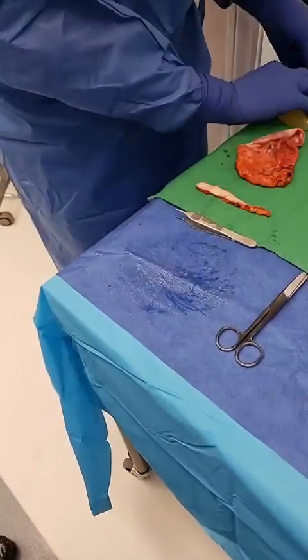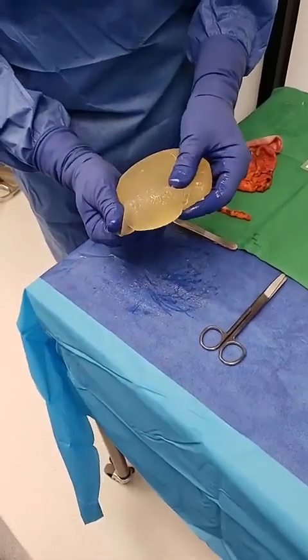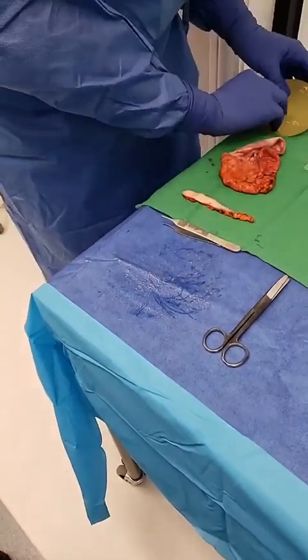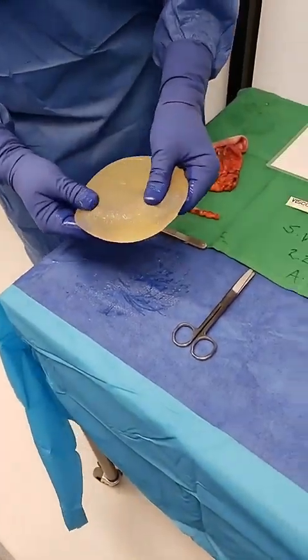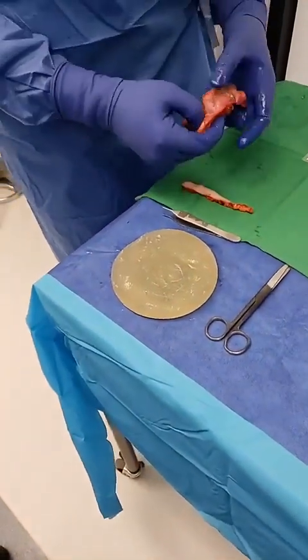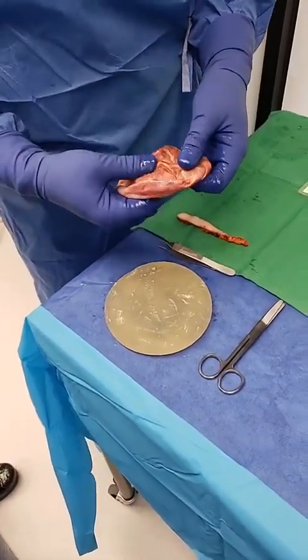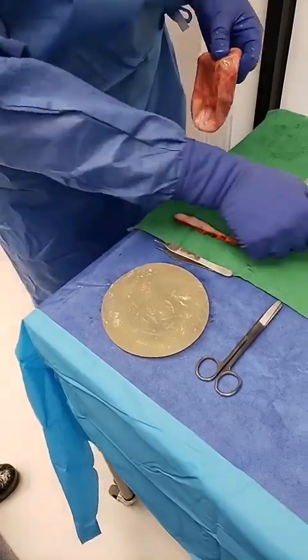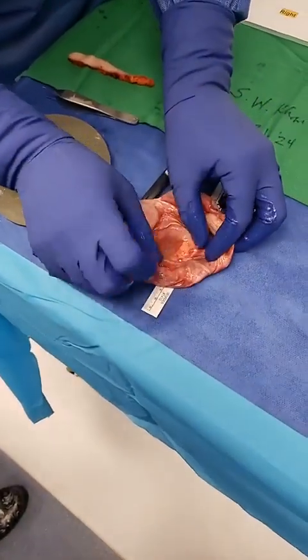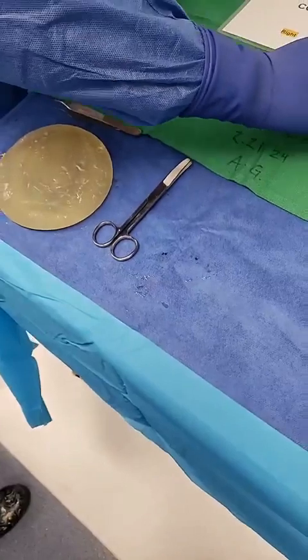Now, what I'm going to do is, I'm going to go ahead and see. I see no information on the back that tells me the manufacturer. There's nothing. Usually there is an imprint or writing. And then let's see the capsule, complete en bloc. Some areas relatively thick, as you saw over here. Some areas thin. You can see, look at my glove. So if I put the ruler here, you can read out the numbers 8, 9. It doesn't take much to cut into.